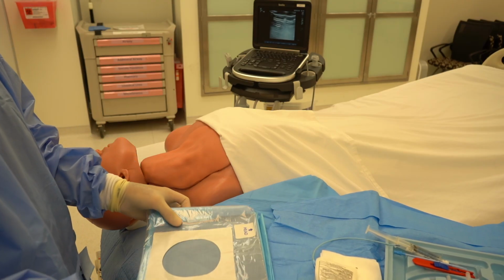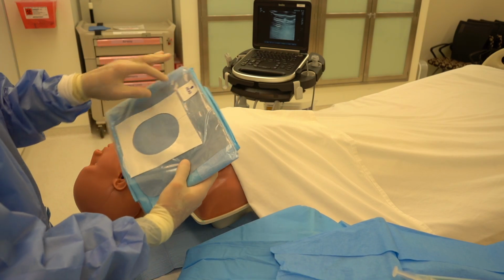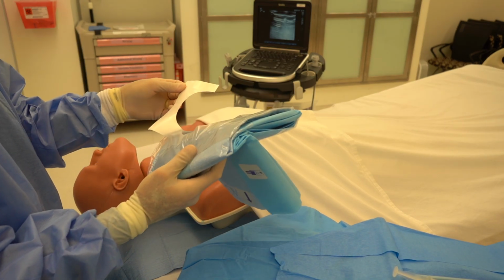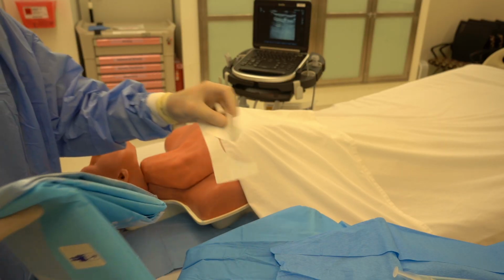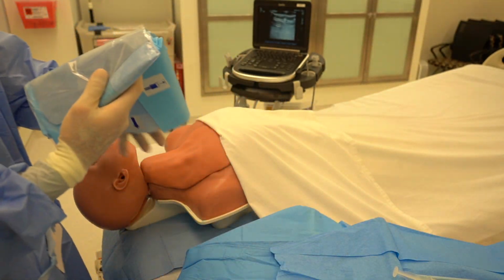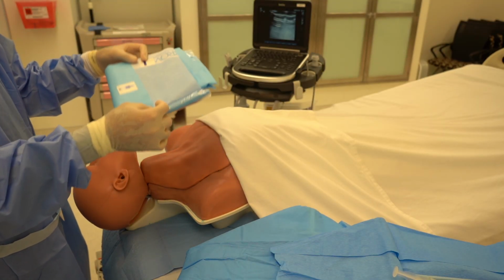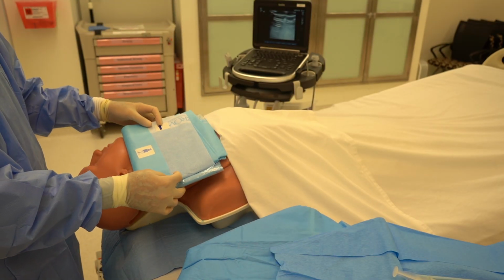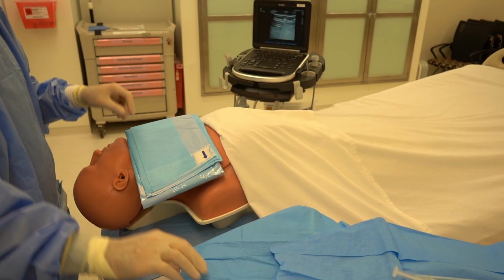And at this point, we'll grab our drape, which has some instructions to help guide us. It is a little bit cumbersome in a large drape, and you want to be thoughtful about how you're placing this. We want to ensure that it's perfectly parallel to our patient and the bed, more specifically. We have our site marked. Essentially follow the arrows on our draping.